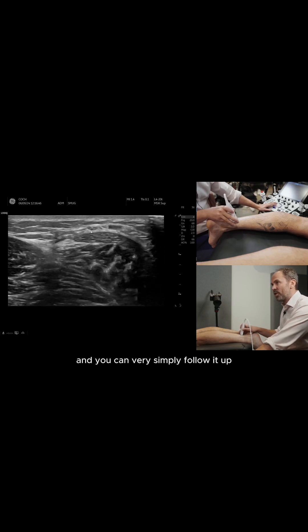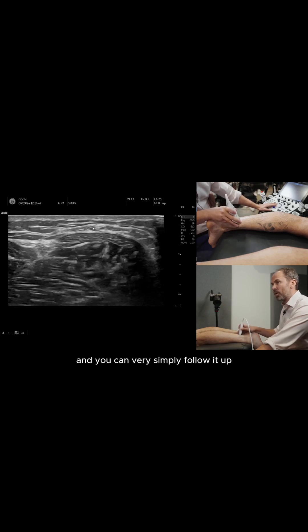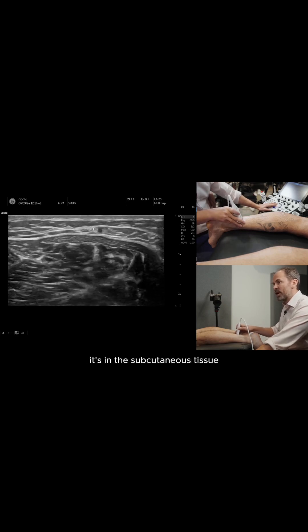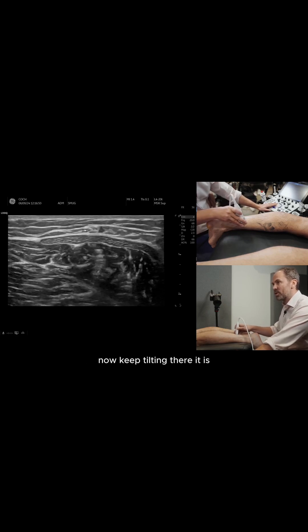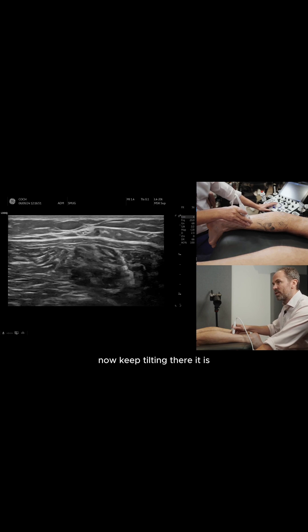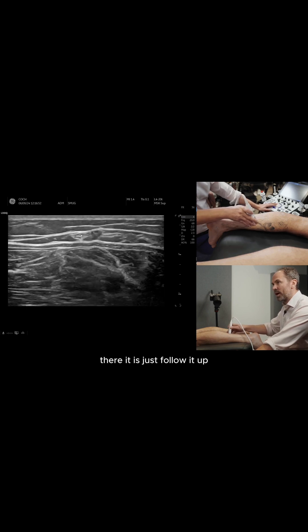So that's the sural nerve and you can very simply follow it up — it's in the subcutaneous tissue now. Keep tilting and just follow it up.